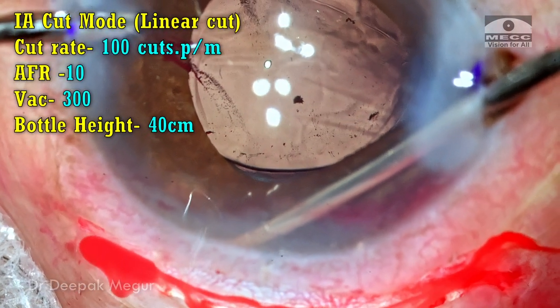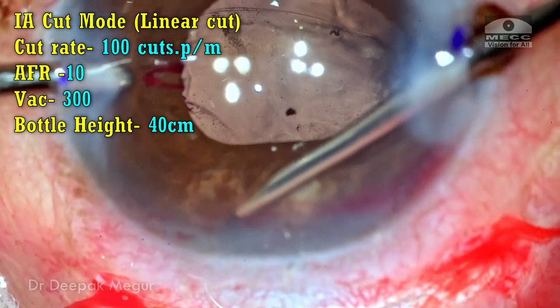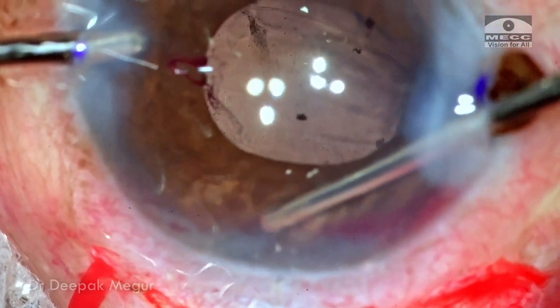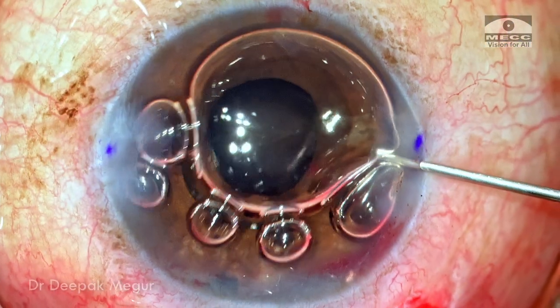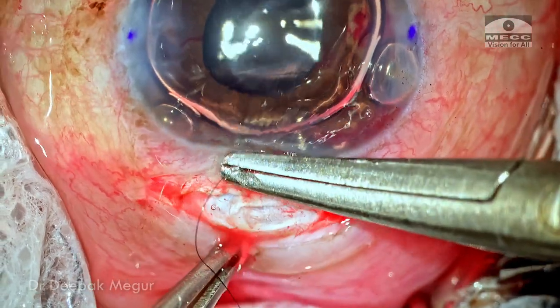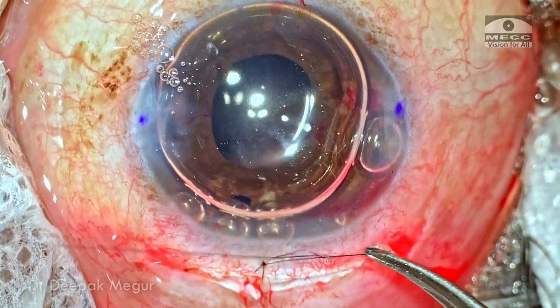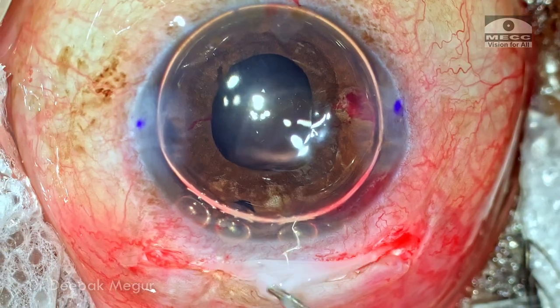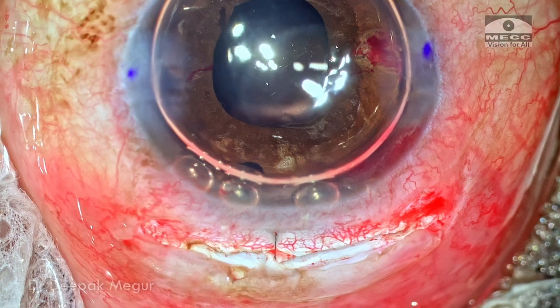I perform a peripheral iridectomy using the vitrector in the superior quadrant with irrigation on through my second irrigating handpiece. I use IA cut mode with very low cutting rate to aspirate the iris and then cut. The iridectomy is to safeguard against secondary glaucoma if the patient develops inflammation and pupillary block. Time to close — I put in an air bubble and place a single stitch in the superior incision, primarily to minimize astigmatism induced by the incision. Triamcinolone acetonide is placed in the wound and the area is visualized for any vitreous — thankfully there is none.